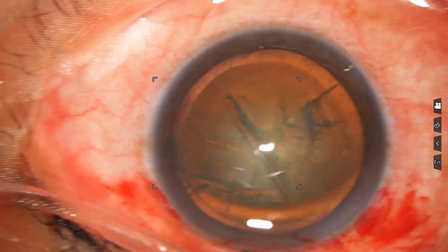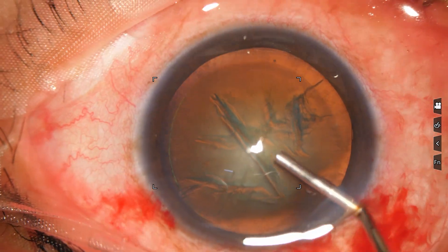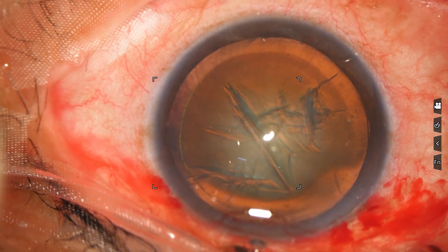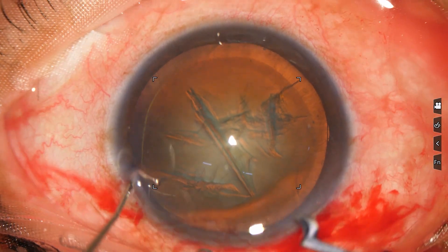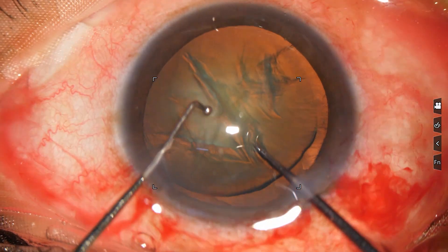Hydrodissection is being done. Hydrodelineation is also attempted. We have got a faint golden ring in this case. Now, the use of the pre-chopper.